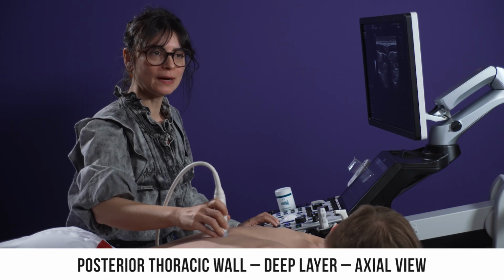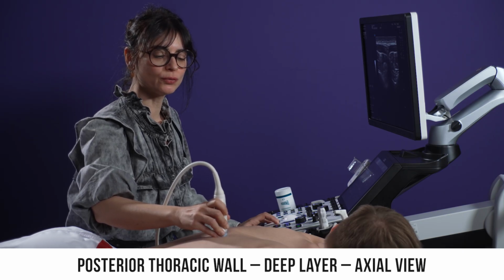In this section, I will show you how we can use ultrasound to visualize the different anatomical structures we've just discussed. First, we will examine the deep layer at the thoracic and lumbar levels, and then move on to the superficial muscles, rhomboids, trapezius, and latissimus dorsi. Let's begin with the deep layer at the thoracic level.